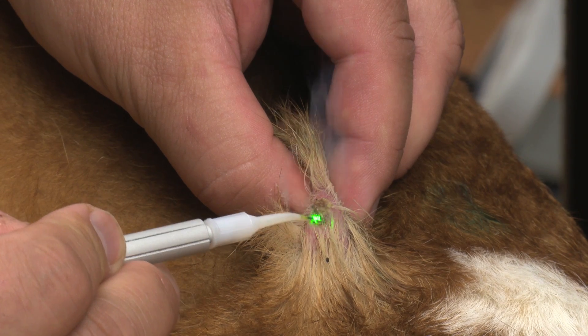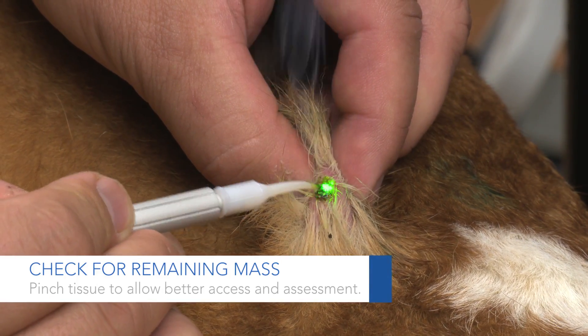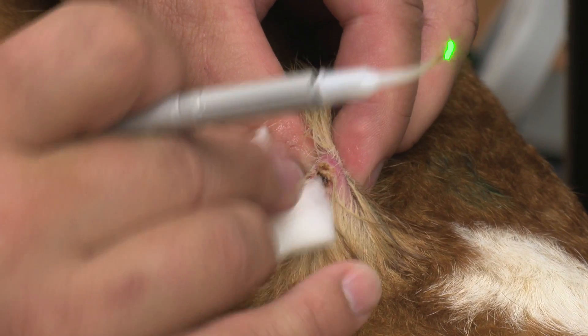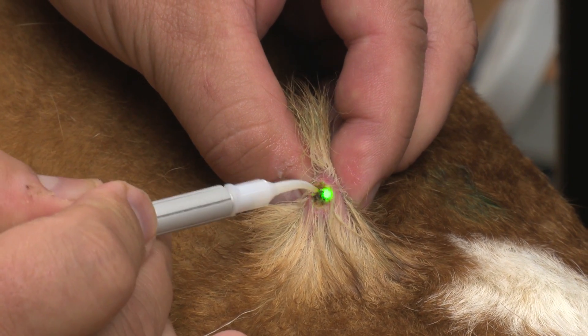I like to pick up the tissue between my fingers so I can feel if there are any masses or remnants of the mass still remaining. And it gives you better access to it — kind of brings it to the forefront.